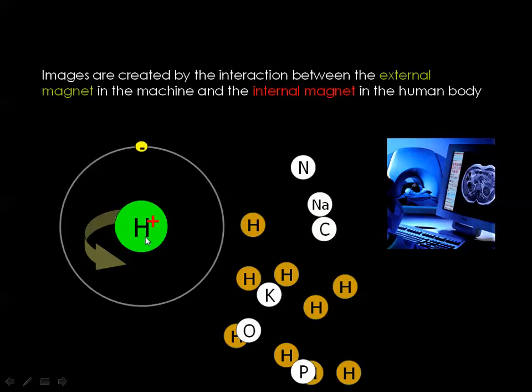which is present in large amounts in the human body, since the MRI machine cannot deal except with a single type of proton. And if you consider that each proton will contribute to a point in the image, then you will select the most prevalent proton at all in the human body, which is hydrogen.